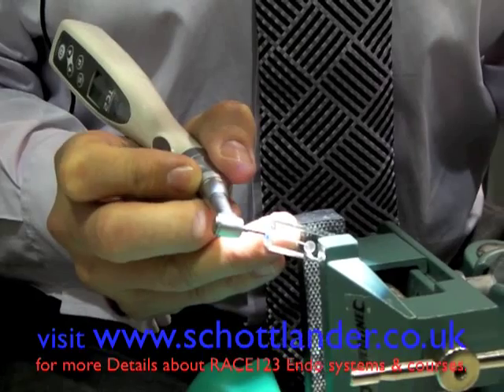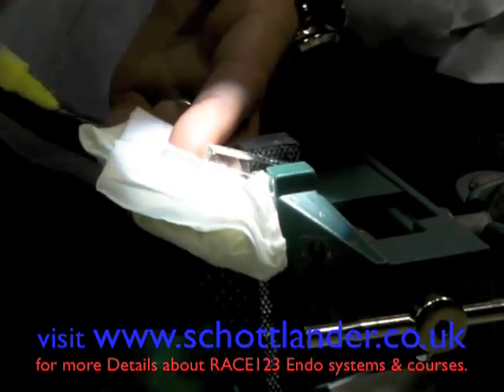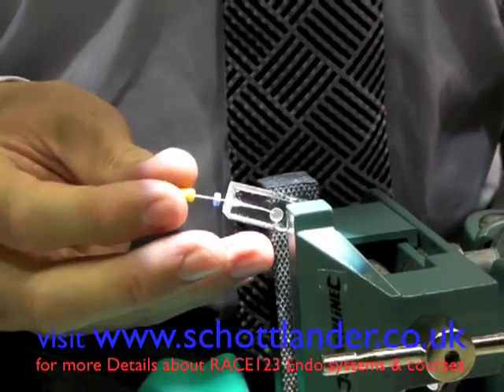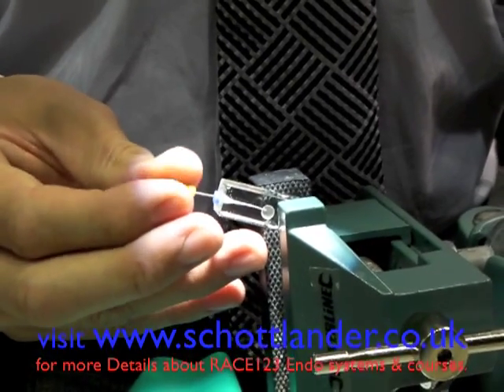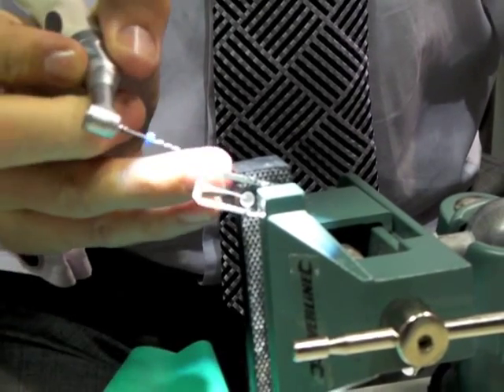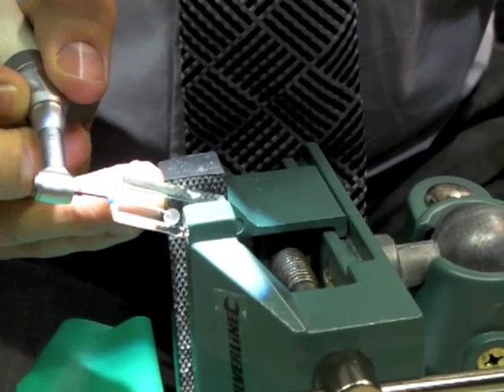We use a very gentle in and out motion until the file reaches our working length, and then we come out and re-irrigate. We then use a size 20 steel hand file and gently watch-wind that to our working length to establish a good apical glide path, which will then allow us to go to the T2 instrument, which is a 2505.